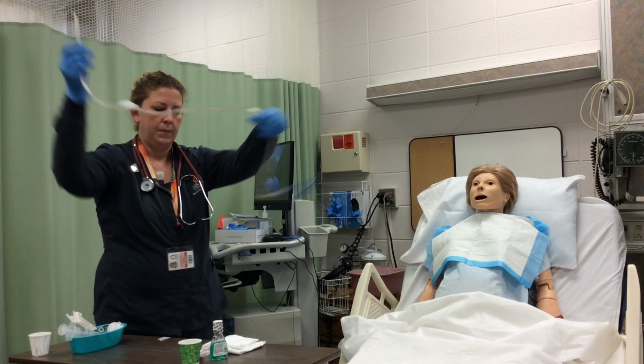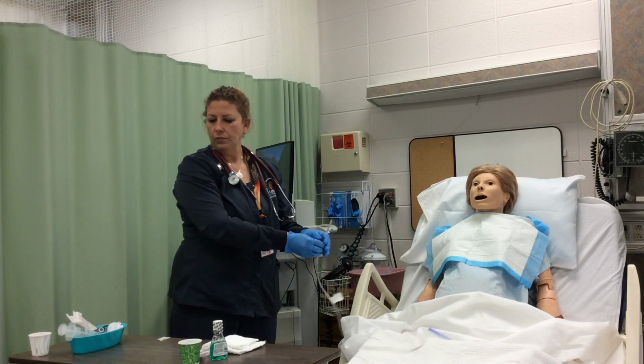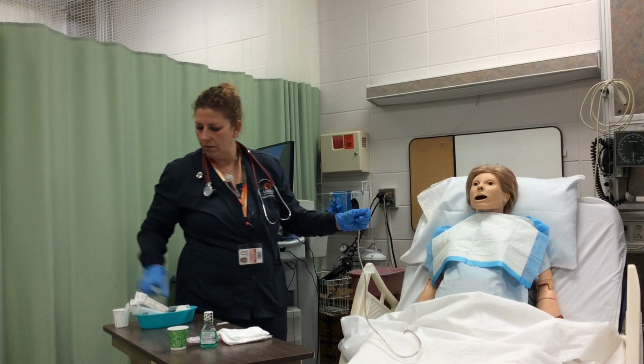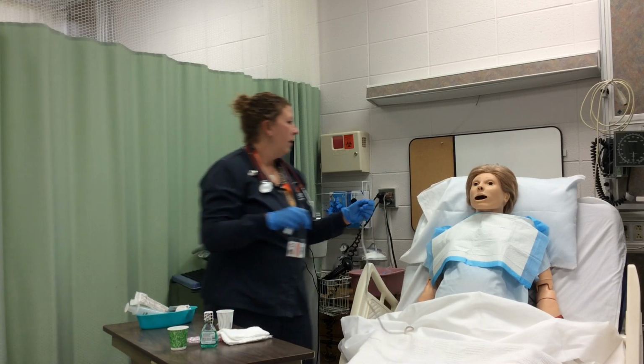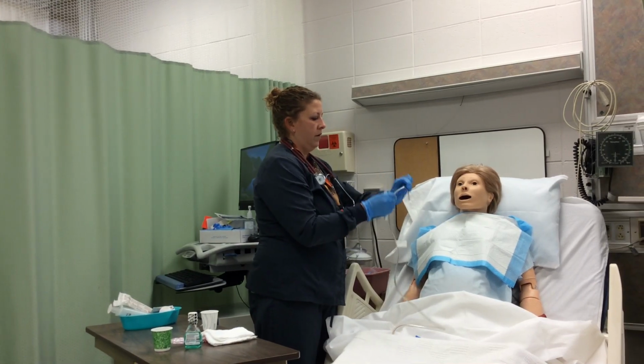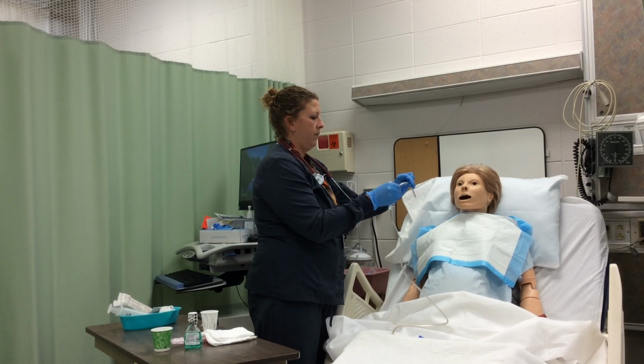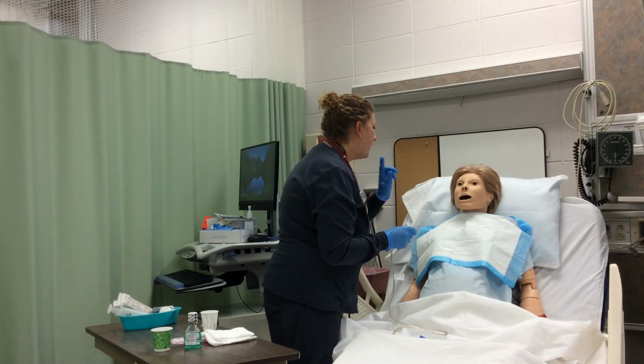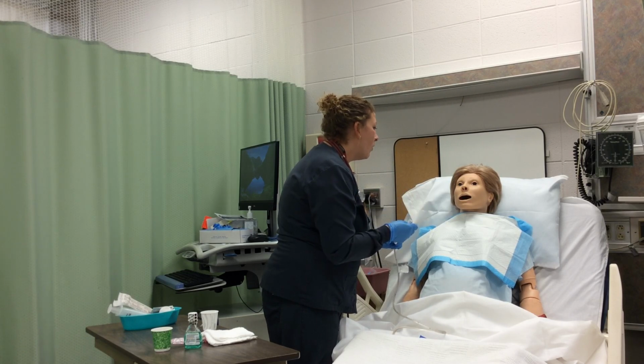Explain the procedure to the patient, then gently insert the tube through one nostril to the back of the throat or posterior nasopharynx, aiming back and down toward the ear. The patient may gag. I'm going to begin inserting the tube now into the left side of your nose. This may make you gag.